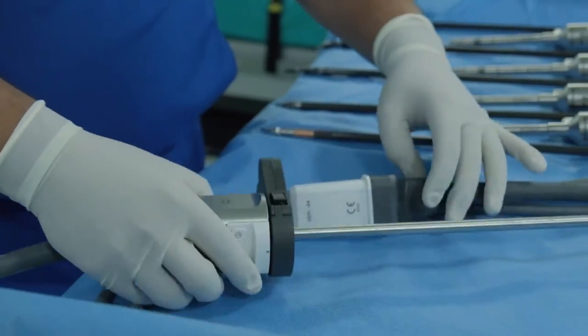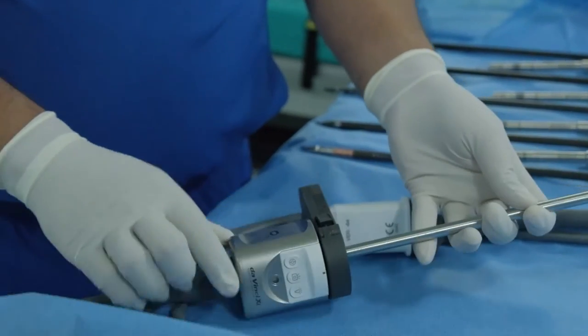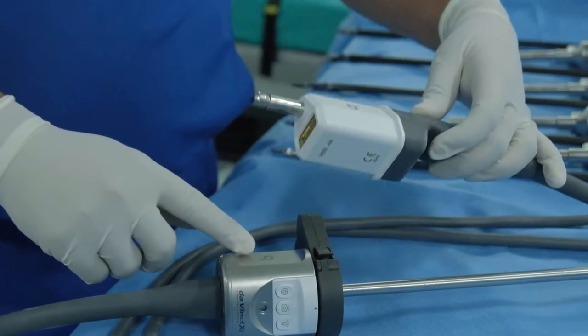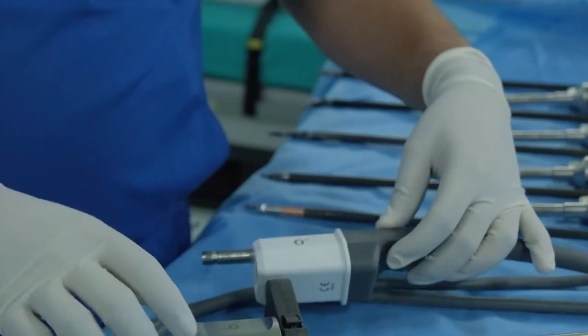So this is the endoscope, the robotic endoscope. You can see here 0 degree is written. It has two endoscopes in one endoscope. And this is the portion which goes into the vision cart.